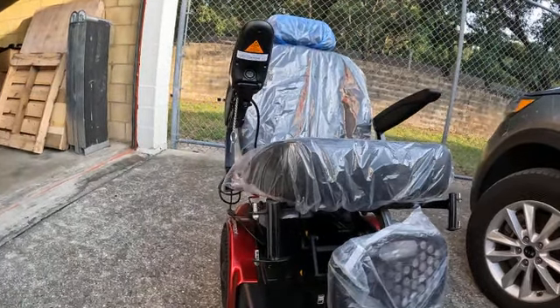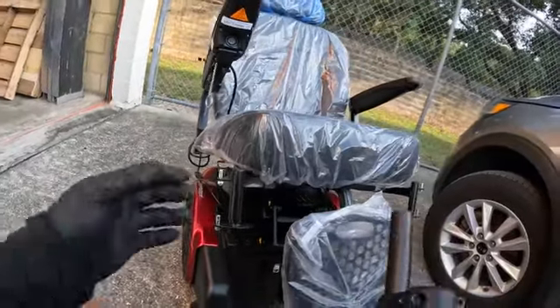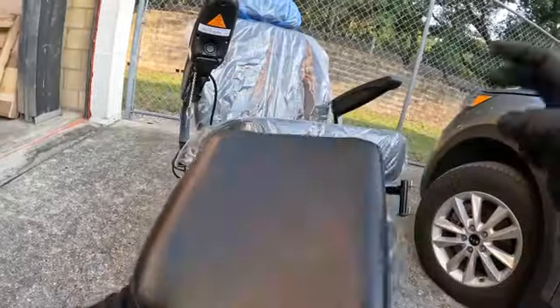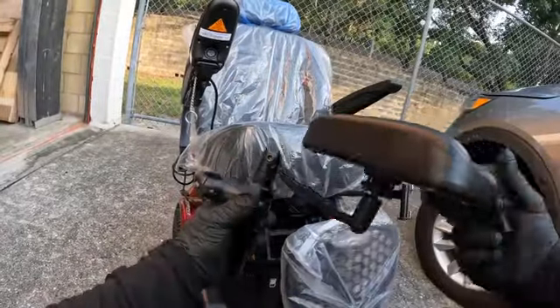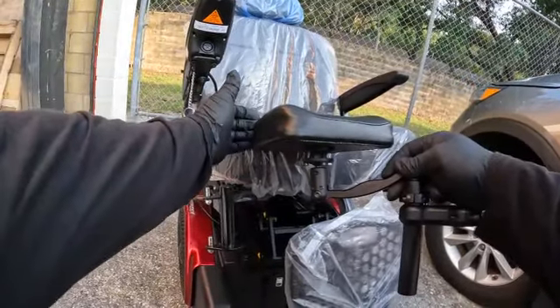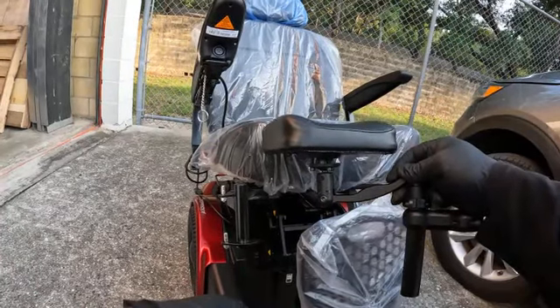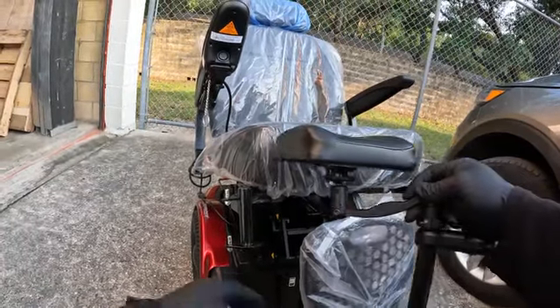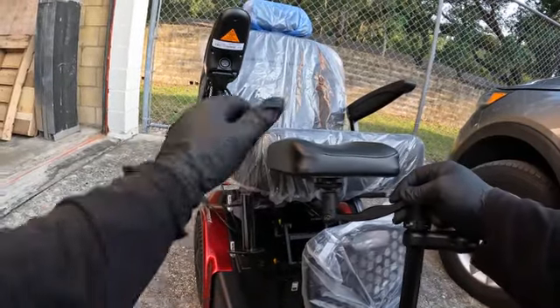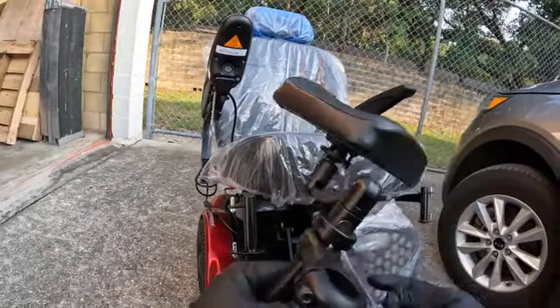Let's talk about the Shoprider XLR14. I'm going to install a limb support or stump support on this unit. This right here is your stump support. The way this fits, you want to make sure it fits as flush as possible to the seat base or cushion. You are able to bring it out a little bit depending on the length, but typically you want it close so the leg is not hanging down.